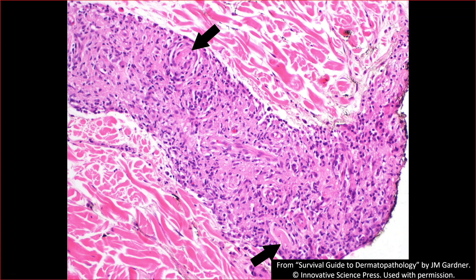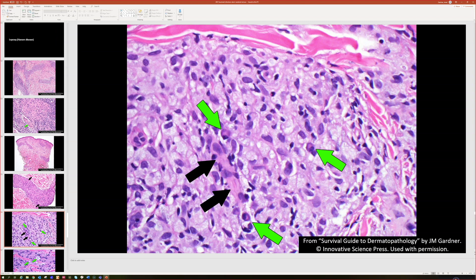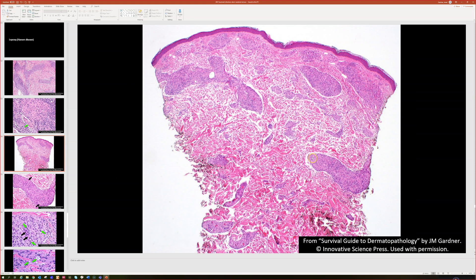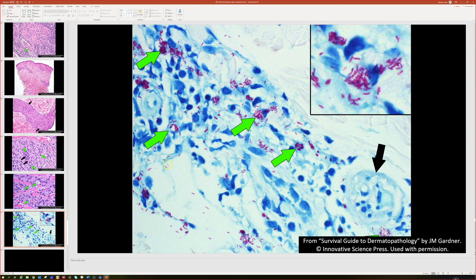Here's another example at low power — you can see how linear the granulomas are, but when you get closer, the histiocytes have a more frothy, loose cytoplasm and you begin to see globi. This was lepromatous leprosy. Lepromatous can make this serpentine granuloma pattern, but the cells look different from tuberculoid leprosy where they're dense and pink. The easy distinction: on Fite stain, if you see one or a few organisms it's probably tuberculoid; if you see a thousand organisms, it's on the lepromatous/multibacillary end of the spectrum.